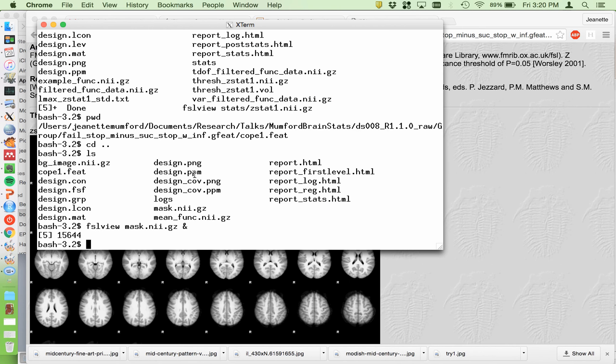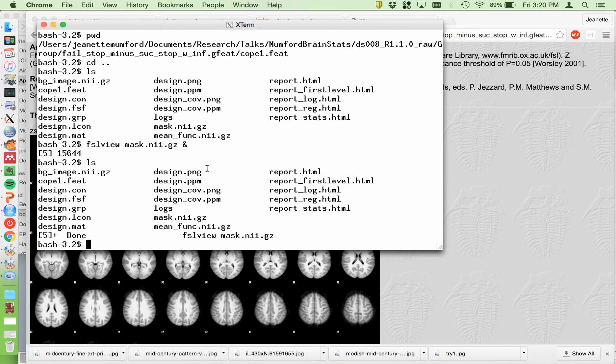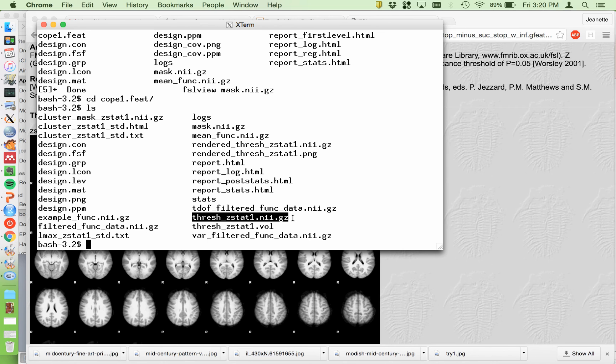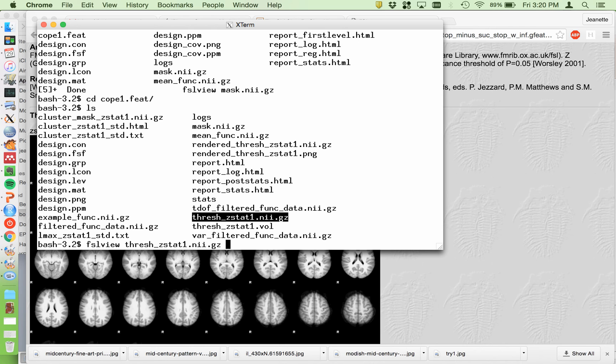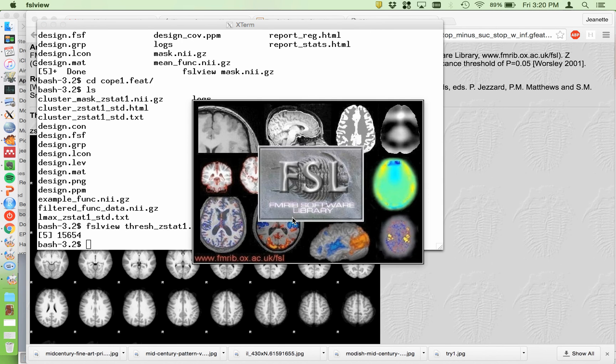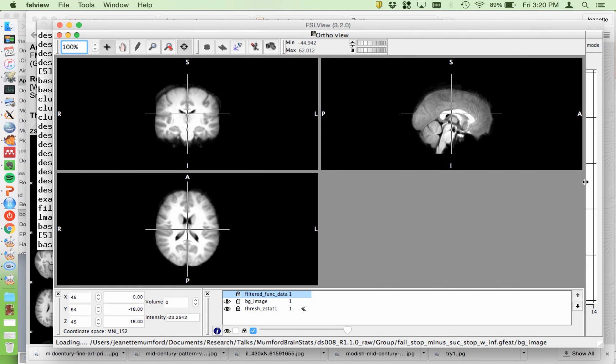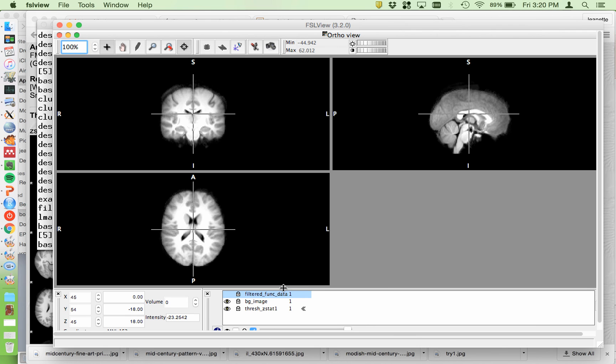Now if we go into the cope1.feat directory, here is where you'll see the thresh_zstat1.nii.gz. So this is corrected for multiple comparisons and you can look at this on the background image. This is kind of a waste of time because I know there's nothing there, but this is how you would load it. Okay, it always loads the filtered func data.